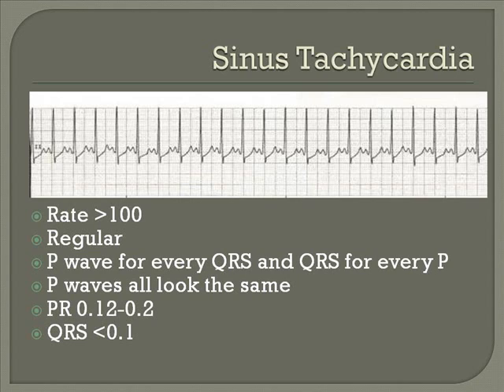If your patient is laying in bed relaxing and they have this heart rate, that's usually more likely a sign of some type of volume depletion, such as they're dehydrated or have lost blood. And this is just one more component of your total picture that they have a fast heart rate from some other cause. Again, depending on how your patient is doing, tells you whether this is a serious rhythm or not.